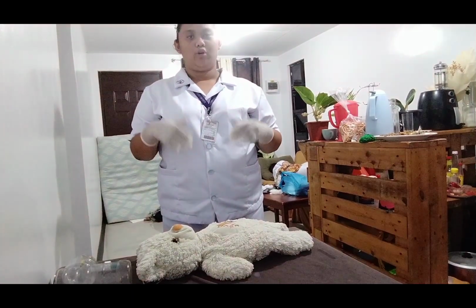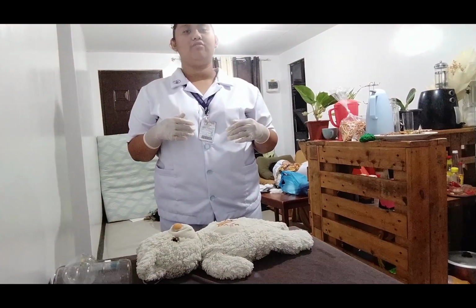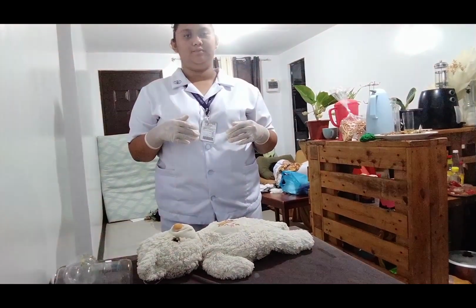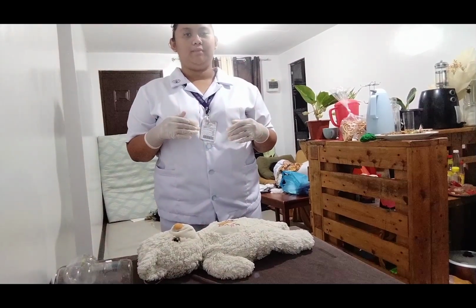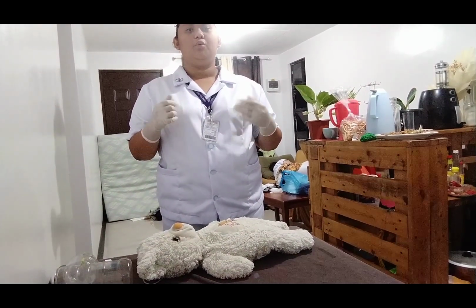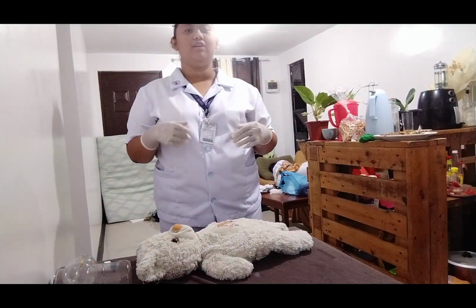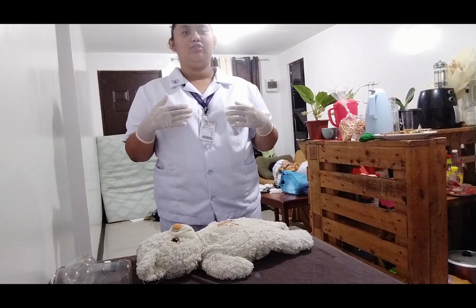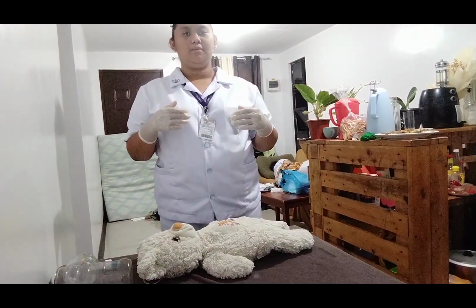to activate the code blue or doctor's quick so that the doctor and the nurses could come over and help us to revive the baby. So what we'll have to do next is to open the baby's airway. So we'll have to suction the baby's mouth and nose using the suction valve. We'll have to remove the secretions if there are any that are obstructing the baby's airway.